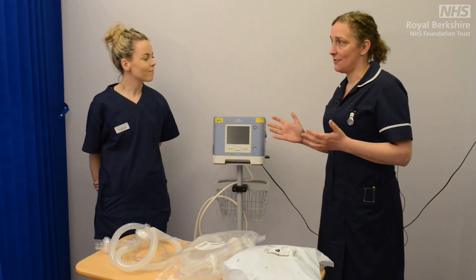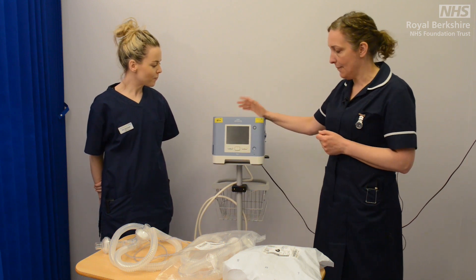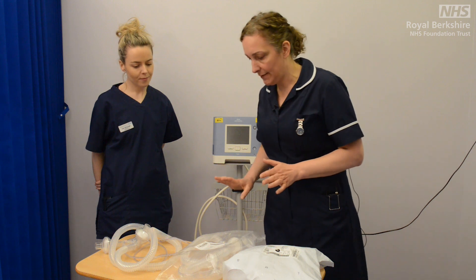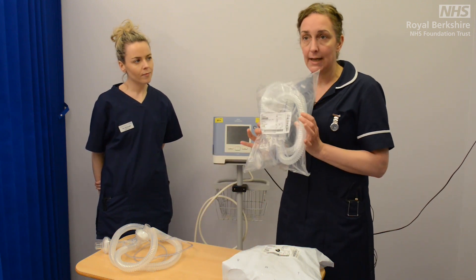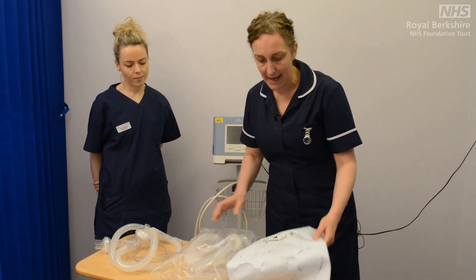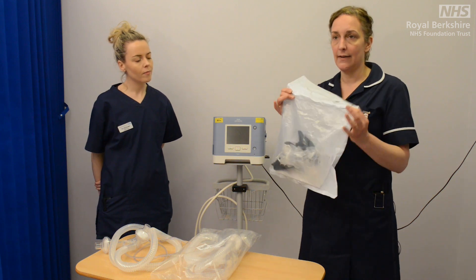First thing we need to do is gather our equipment. We're going to need our Trilogy ventilator, which we've got here, and we'll go through setting that up just in a moment. Other bits we need are our consumables — first is our ventilator tubing, and the packaging will look like this, and then it will be our masks, and again the packaging looks like this.